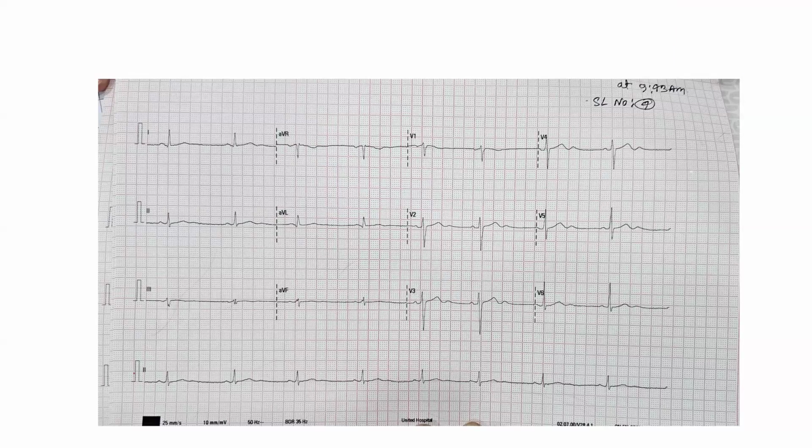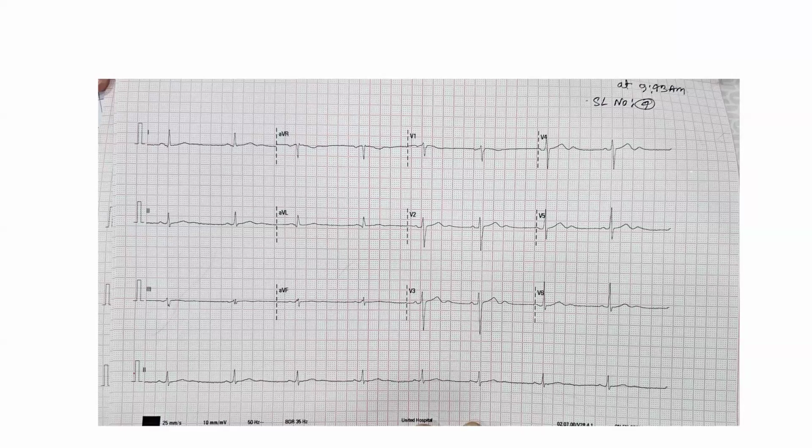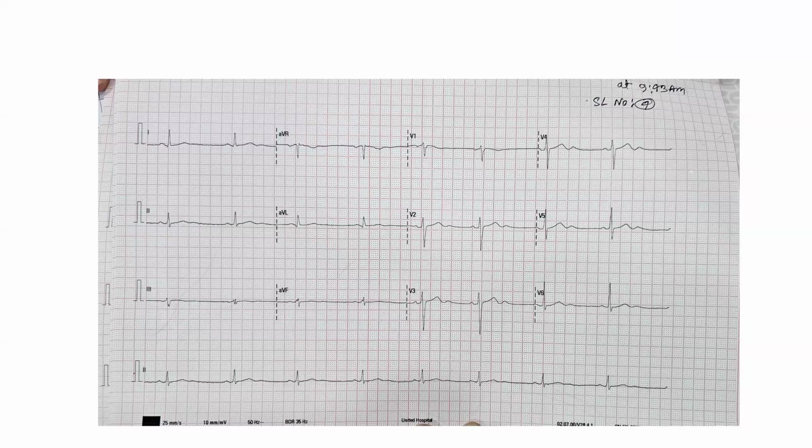Against the 2:1 block is the point of the PP interval. U wave simulating P wave. PP interval is not regular then. In that case, the PP interval would be regular. And there is a morphology difference between the U wave and the P wave. Morphology different.